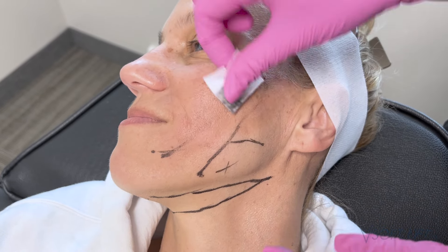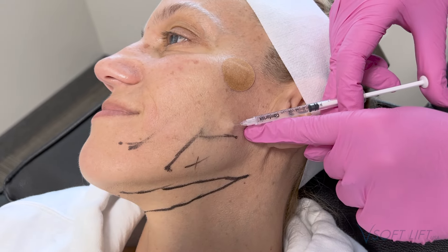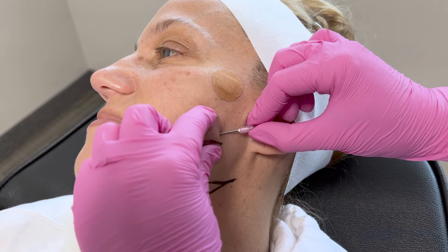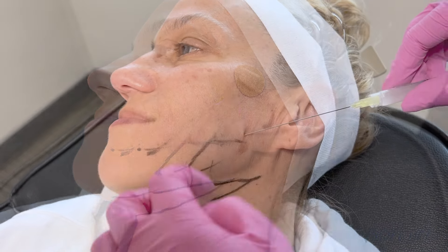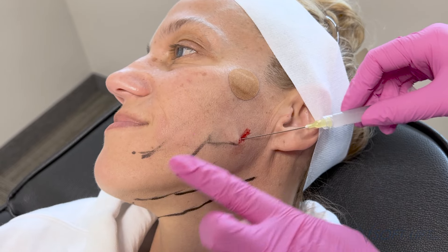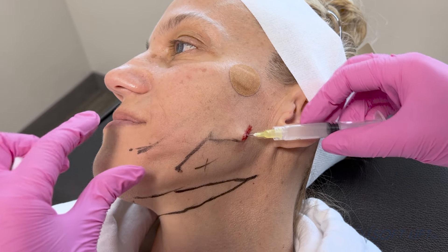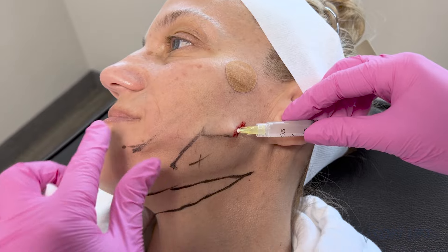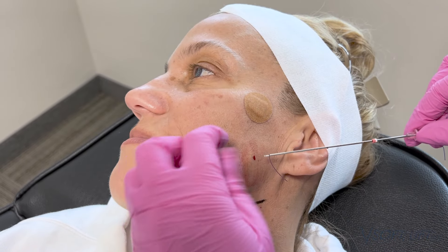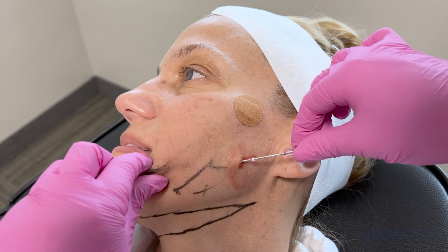Once I have my three threads placed, I do a very gentle pullback to make sure the barbs are engaged. I'm not yanking — very light pressure, just confirming the barbs have engaged without pulling the thread out. We want the thread to remain inside the tissue as a foreign body, stimulating the body to break it down and stimulating natural neocollagenesis. That's what's going to build our collagen. Sometimes a few barbs pop into place — I let patients know they might feel a couple of zingers post-treatment for the next few days. Now moving on to the jawline.